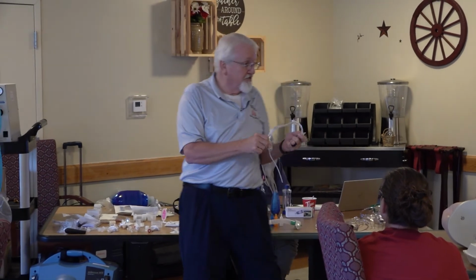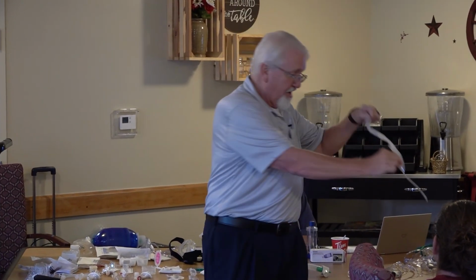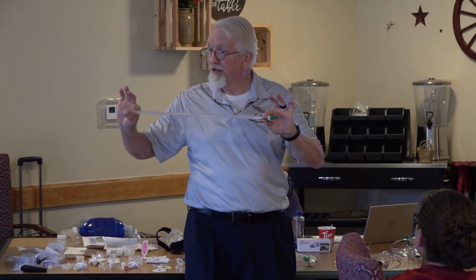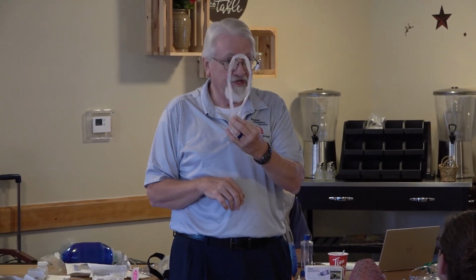Same process. I meet till I meet resistance. I did. Back it up. Now I'm suction, and I come on out. There you go. Thank you. And I come out. And it's the same process, and I'm only going to do it the one time. I flush with some water, and I'm ready to put it back in my pack.